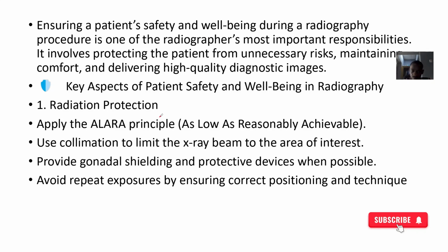Okay, so what are the key aspects of this? You are trying to protect the patient from radiation and ensure that the radiation that the patient is being exposed to is just what is needed, not extra. Do you understand? So applying the ALARA principle, you're using collimation to direct the X-rays to the site of interest. You want to provide gonadal shielding so that you protect the reproductive organs from the exposures.